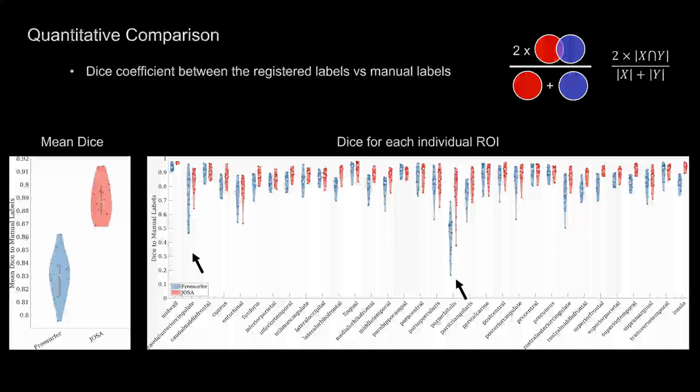So these were manual labels. This is the Desikan-Killiany-Tourville, DKT. Ron Killiany, Jason Tourville, and Rahul Desikan manually labeled. Ron and Rahul, I think, did 40-ish initially, and then Jason redid it with 100. So these are 100 subjects, split into training and test. They're manual labels of the cortical folds, done on surface models. You draw a boundary and say, don't extend further than here, don't extend further than there, and then flood fill the interior. It's not that hard.